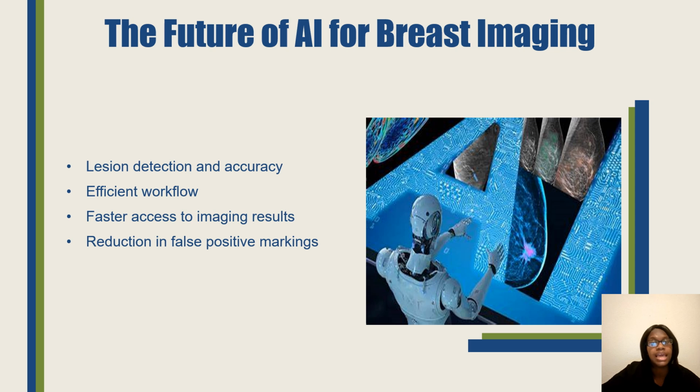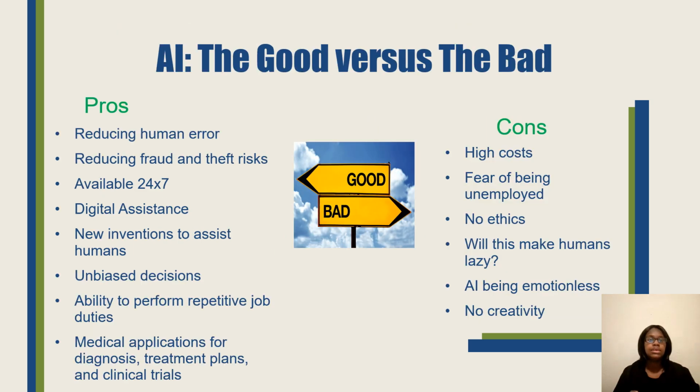The future of AI when it comes to breast imaging is going to be used for lesion detection and accuracy, making sure that we have an efficient workflow, faster access to the imaging results, and it's going to help reduce those false positive markings.